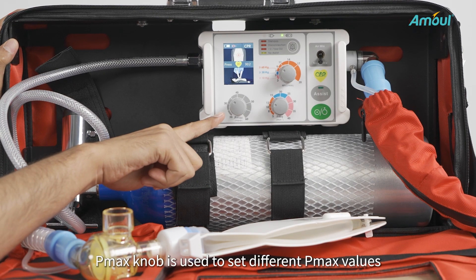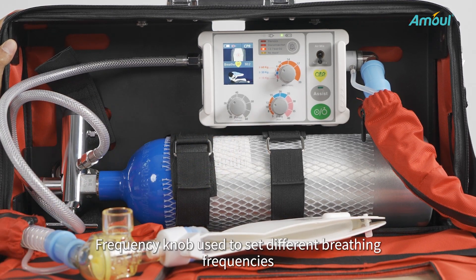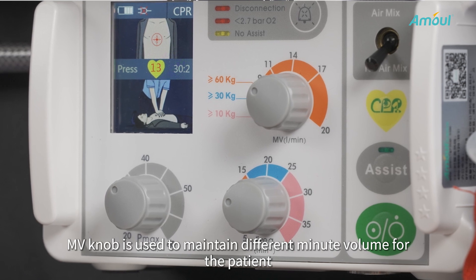The P-MAX knob is used to set different P-MAX values. The Frequency knob is used to set different breathing frequencies. The MV knob is used to maintain different minute volumes for the patient.